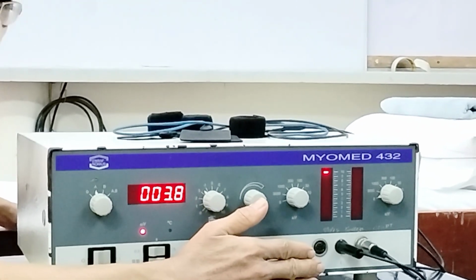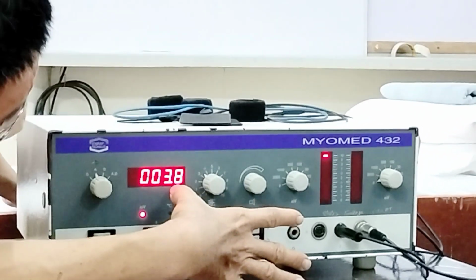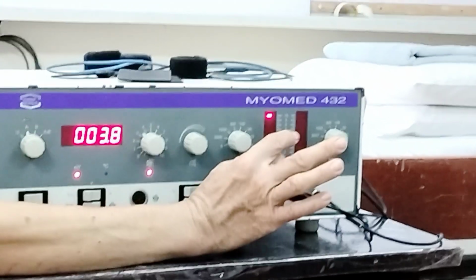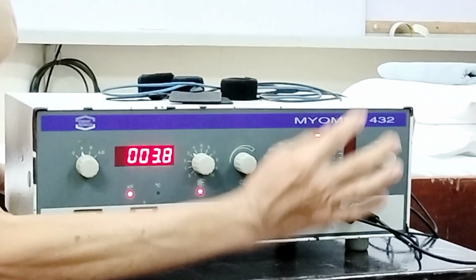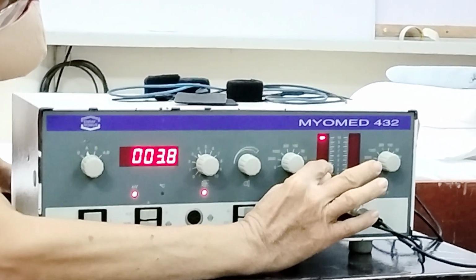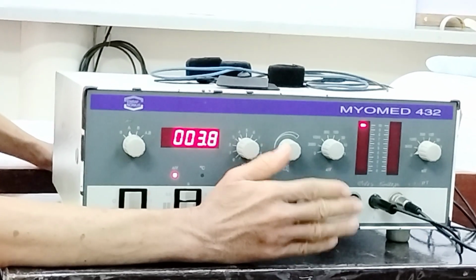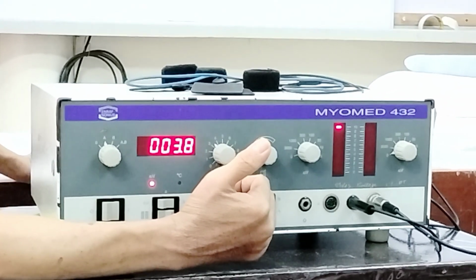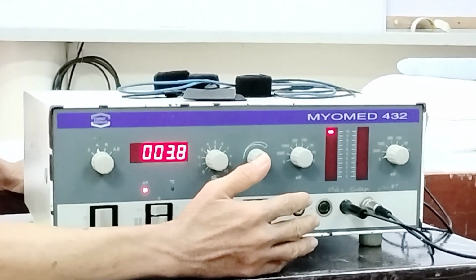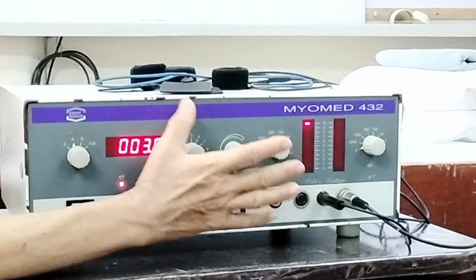Now say you have 3.8 there. If the bar is at the level of 5, so 50%, that means the machine was just able to get a signal that is 50% of 3 microvolts. So therefore, the signal received is 1.5.